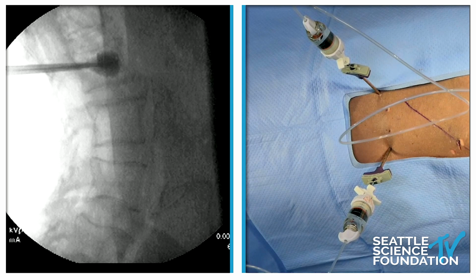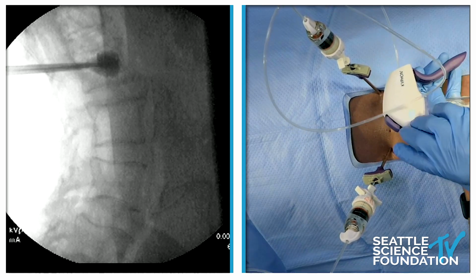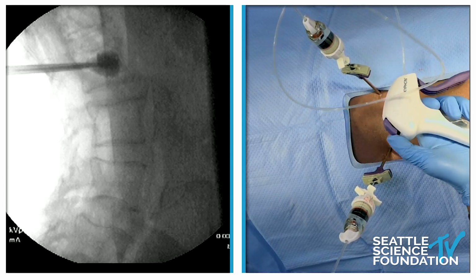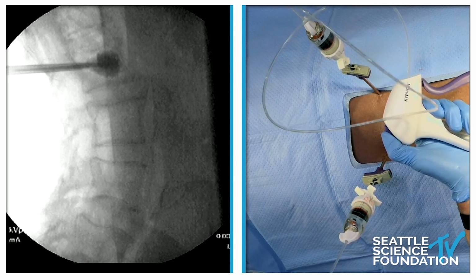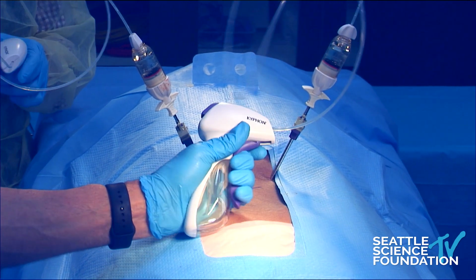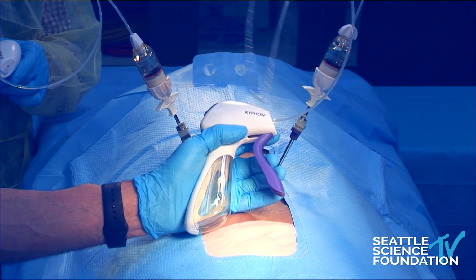And part of this cement delivery system, the CDS, is what we're using here. So the CDS is characterized by a trigger, and this is hydraulic. You can see the water in the delivery system here and here. You can see the cement is going in with the plunger. And the CDS is a quick release valve. So if it's going and there's built up pressure and you want this to stop, you just trigger this on the back and the cement flow stops immediately. So we're getting pretty good cement flow. You could just trigger here, and then the release valve is here. And we can see bilateral with the cement going in, plungers, and the hydraulic system.